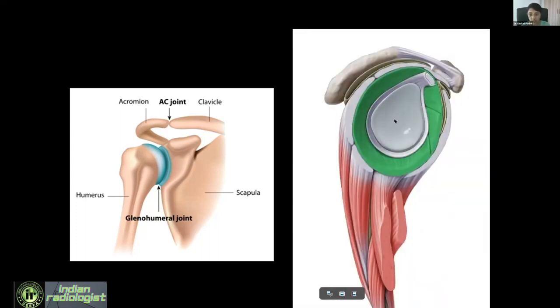The glenoid articular surface is surrounded by a labrum — this thin purplish structure. The green structure around it is the capsule, and around that you have the rotator cuff tendons. These are the soft tissue structures around the shoulder joint that help provide stability, and we need to look at all of these structures in a shoulder scan before labeling it as normal.